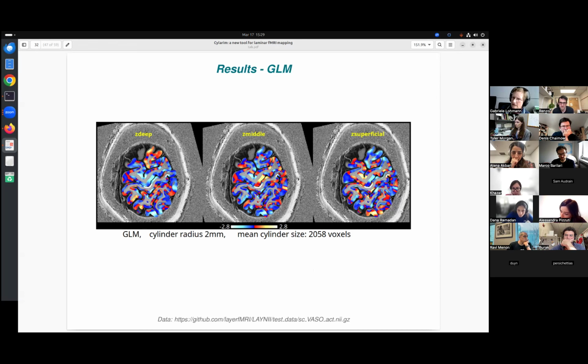I should add that in this case, I haven't used equivolume correction at all. This is just equidistant correction. I don't know if that would perhaps make a difference. Perhaps it would. I'm not quite sure.